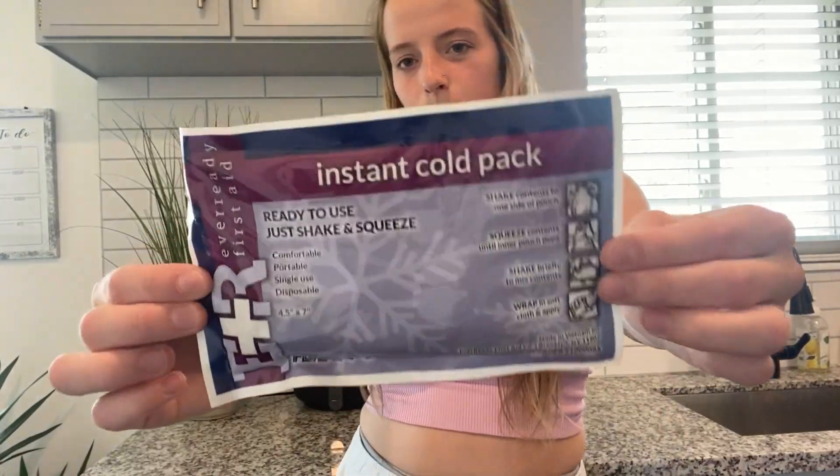Hi guys, it's Jayla. Today I'm going to be reviewing the instant cold packs. This says it comes with 125 and they are single-use, so you do want to dispose of them once you're done with a package. I have absolutely loved these — they're just great to have on hand. You can put some in your car, in your medicine cabinet, really anywhere. These are super awesome.